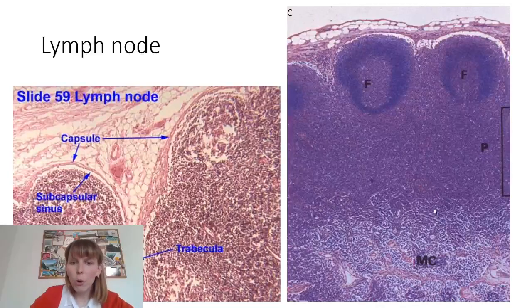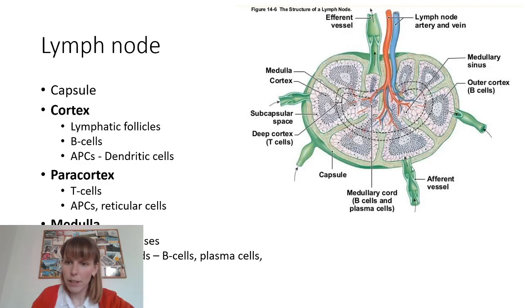So lymph node with vas afferens going in here, the lymph traveling through to the medullary sinuses and out of the lymph node. The point of this is you flow all the liquids from the tissues, the lymph, through this organ, and all the special immune cells, B and T lymphocytes, have the chance to see what's inside of all this liquid gathered from the tissues.